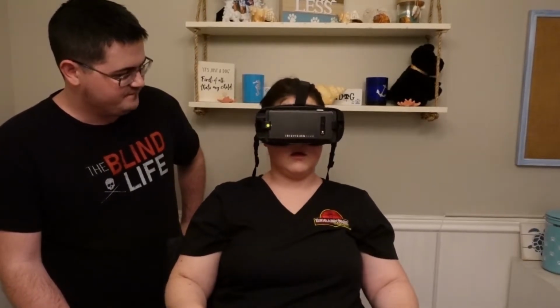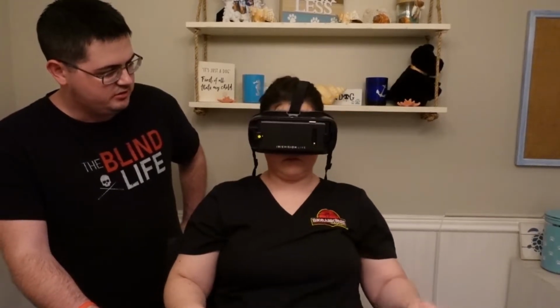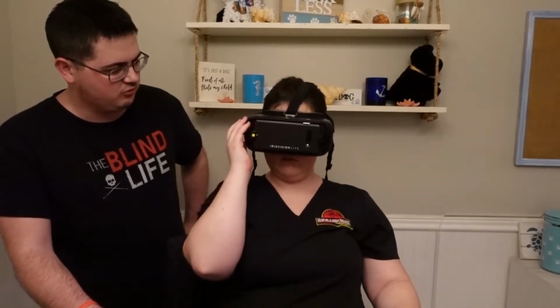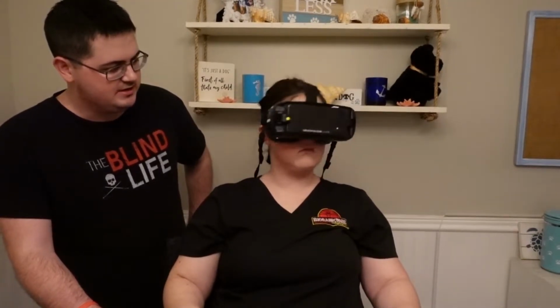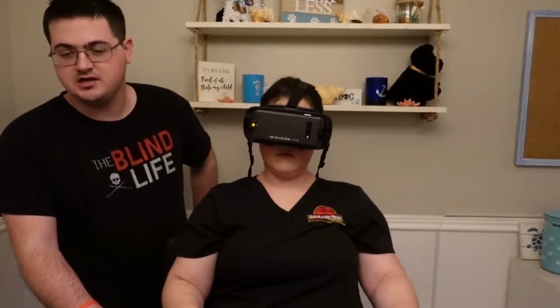But it does allow you to manipulate what you're seeing, and it allows you to put things into that little circle. And of course, you can magnify it or decrease it, but that does allow you to manipulate your disease so that you're getting more out of basically what you can see in your field of vision.